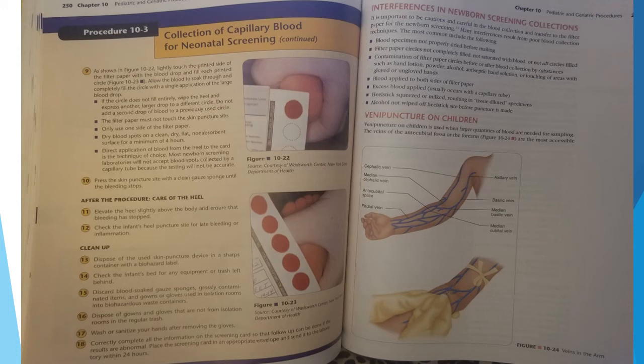The filter paper must not touch the skin puncture site. Only use one side of the filter paper. Dry blood spots on a clean, dry, flat, non-absorbent surface for a minimum of 4 hours. Direct application of blood from the heel to the card is the technique of choice. Most newborn screening laboratories will not accept blood spots collected by a capillary tube because the testing will not be accurate. Press the skin puncture site with a clean gauze sponge until the bleeding stops.